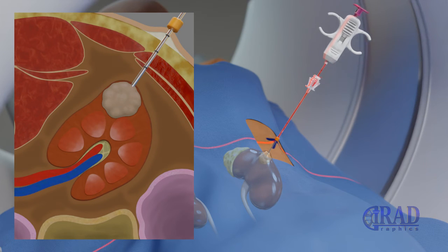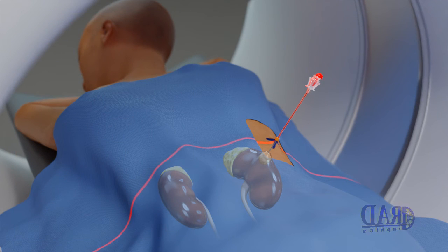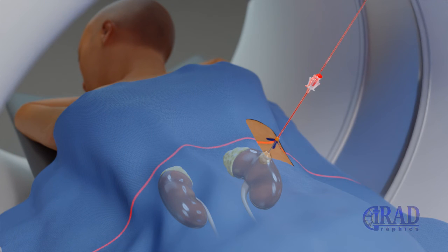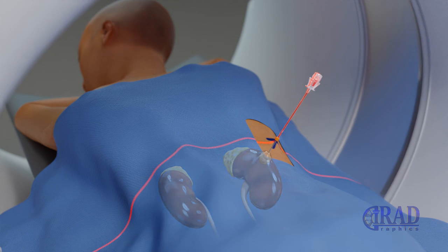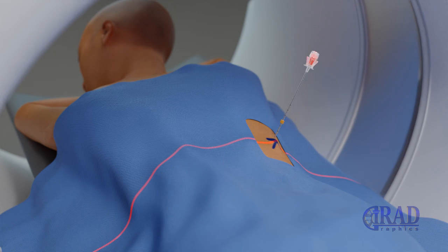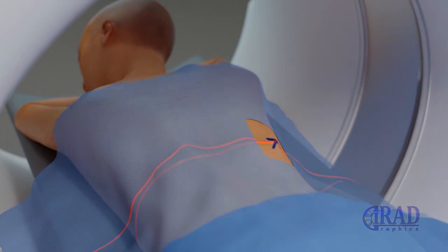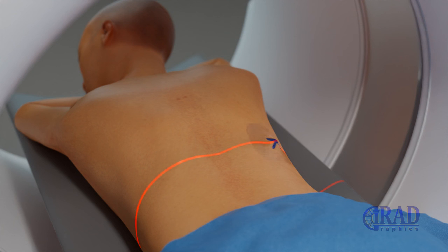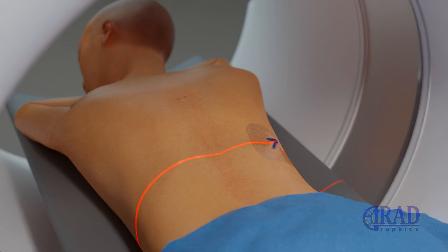The entire procedure usually takes between 30 to 60 minutes. At the end of the procedure, the biopsy cannula is removed and pressure is applied to stop any bleeding. Subsequently, dressing is applied at the opening on the skin.